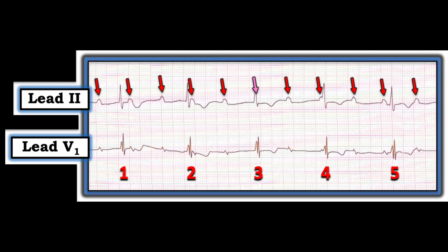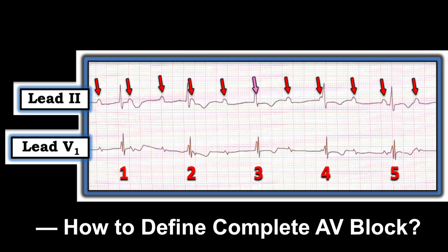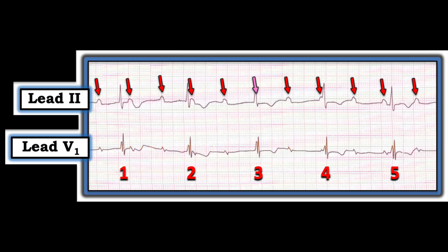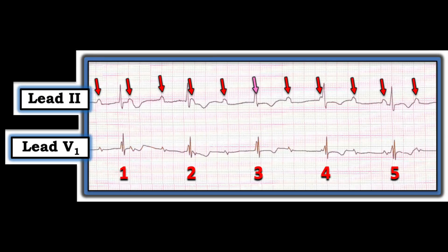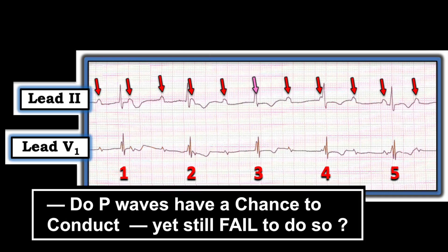P waves are marching through at a regular rate through the QRS complex with no relation — so third-degree AV block: regular atrial rhythm, or fairly regular atrial rhythm if there's underlying sinus arrhythmia, regular ventricular rhythm, and no relation between them. There is one last part of the definition of complete AV block that most providers, even experienced ones, forget: in order to call something complete AV block, you need P waves occurring at all phases of the R-to-R interval that have a chance to conduct but still fail to do so.